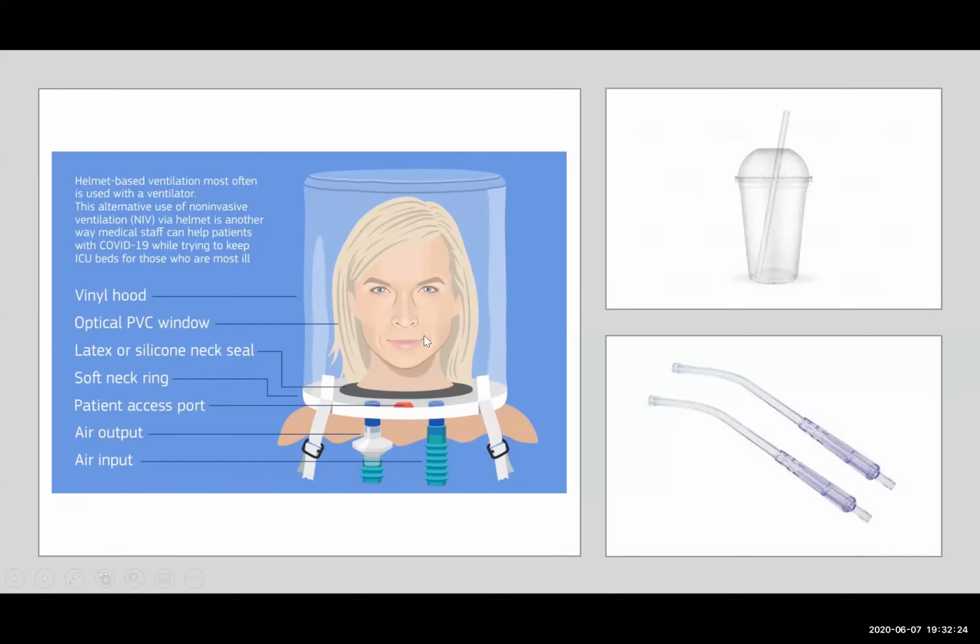So there is no soiling while you're trying to fit the straw into the patient's mouth. You won't be losing liquid inside the helmet. So secure the straw first and then add the cup below. And the same thing when you remove the drink away from the patient: you remove the cup first and then you take the straw out, you put the plug, ensure the helmet inflates, and then watch the patient for a little bit and ensure they are okay on their previous settings. You can bring your FiO2 back to what he or she was on.